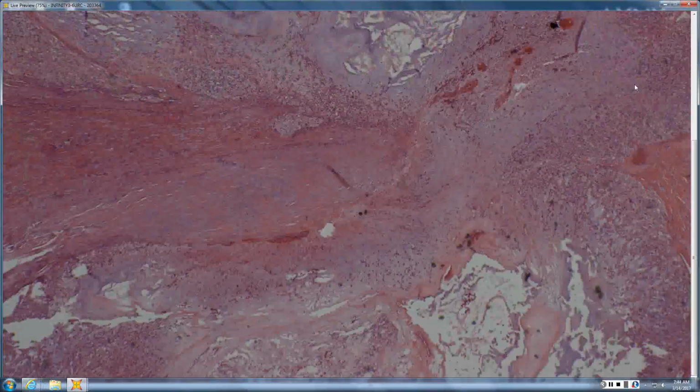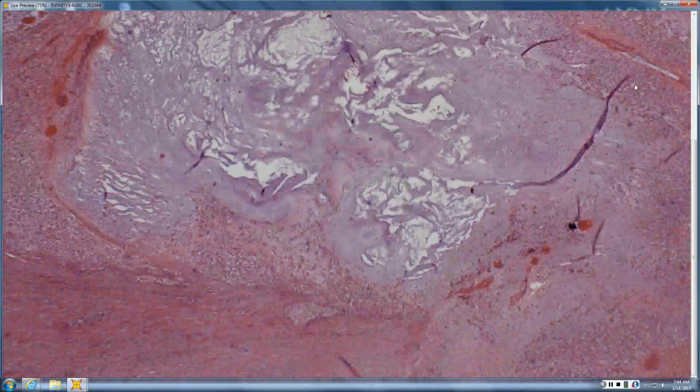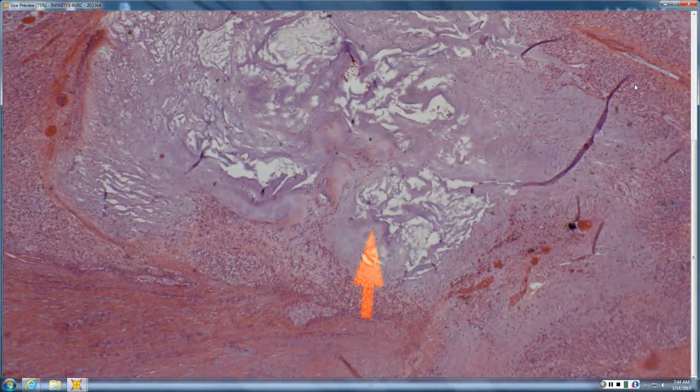Let's see, a large tissue, kind of like varying areas of cellularity, kind of this blue. And what color blue? Kind of a blue-gray, and myxoid. You associate that with what kind of mucin? You see that cartilage? Yeah, or any sulfated mucin. So sulfated mucin tends to be that blue-gray, the most common one being chondroitin sulfate, which is cartilaginous mucin.